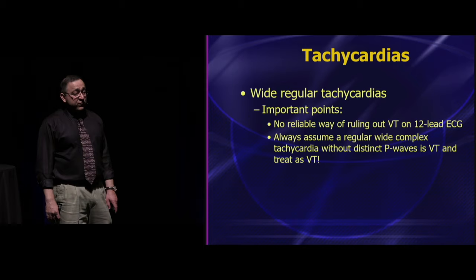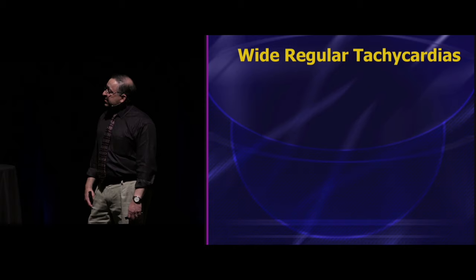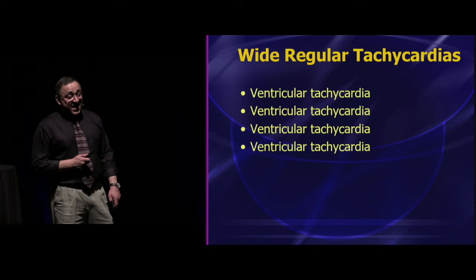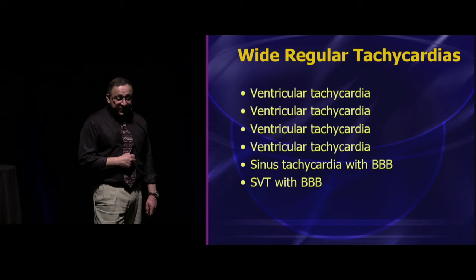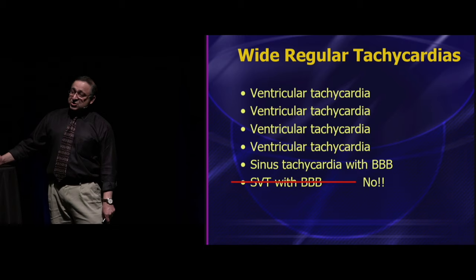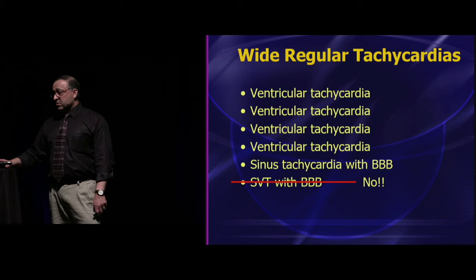So whenever I teach what is the differential for wide regular tachycardia, think VTAC number one. Number two, think VTAC. Number three, VTAC, maybe VTAC, or maybe sinus tach with the bundle, but SVT with the bundle, forget it, all right? And no matter how smart you think you are, there are many, many smart people who have killed patients because they thought too much, they tried to figure it out, they came up with SVT, and it was wrong, right? So just call it VTAC, everybody gets saved.